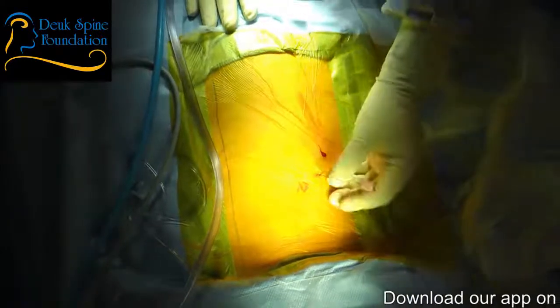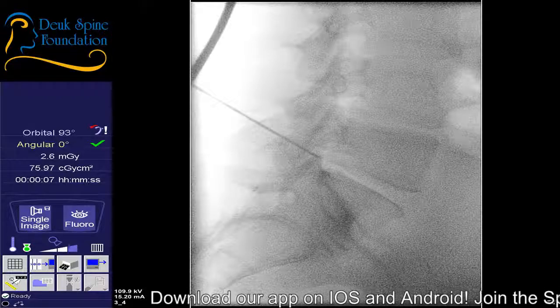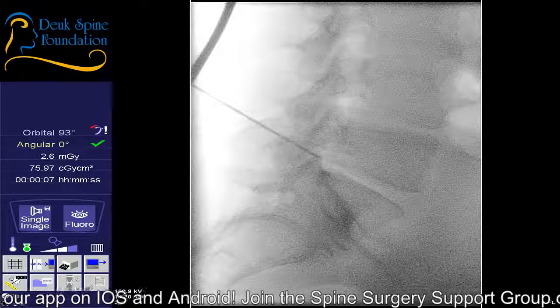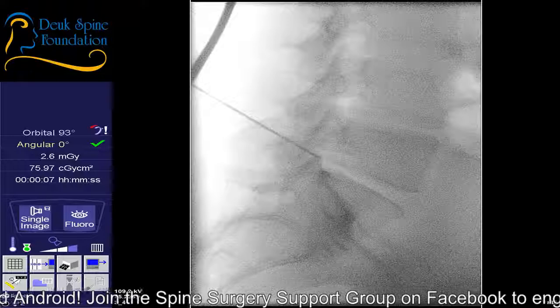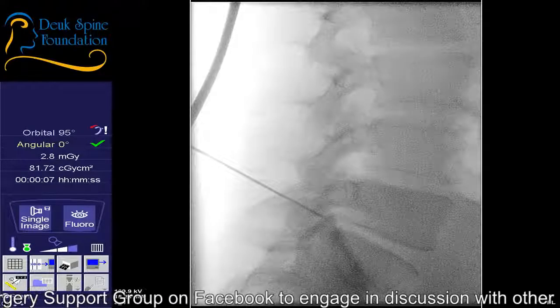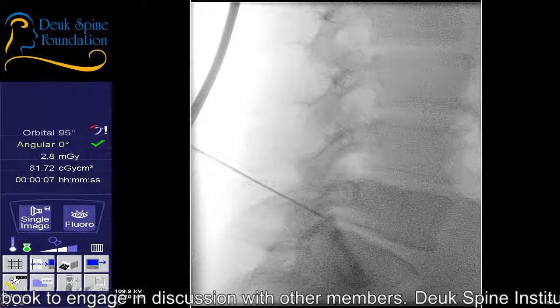All right. Well, let's see what we can do here. It's not bad. It's really not that bad. I wonder if we could try wagging just a little bit and then this type of thing. Okay, you see the facets are not lined up properly. Shot. All right, now let's see, is that better? I think it's better, but it's still rotated. Let's go a little bit more and see what happens. Shot.